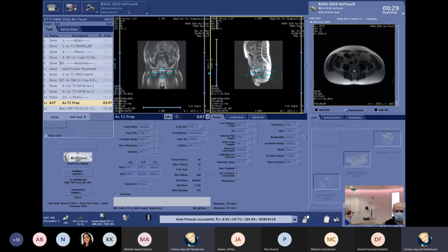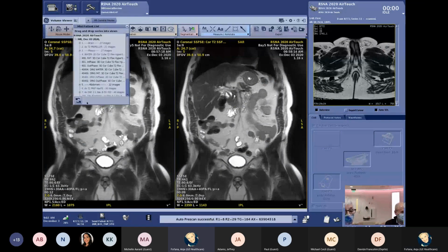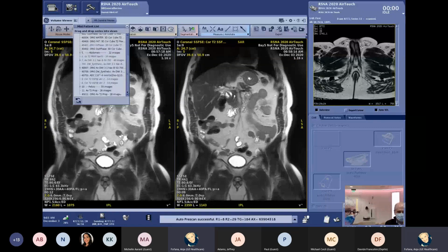So we have about 30 seconds left for this scan. If any more questions, feel free to ask. Be glad to answer any of those. And other than that, we just want to remind you that we started in the brain with really nice images there, and now we are ending up in the prostate, and we both, lazy people, never left the chair. So we really love our new technology because it really helps a lot to be efficient and to be fast. And I really changed my behavior a little bit because I now just pick coils and put them on top of the patient, even though I might not use them, but I still have them available, which is really, really nice.